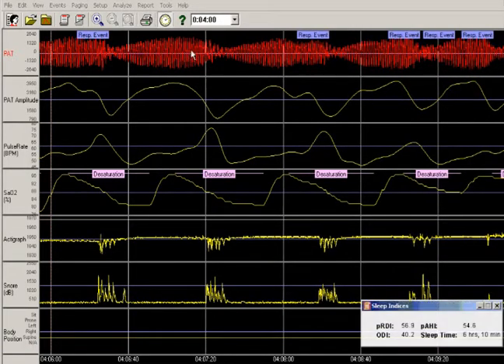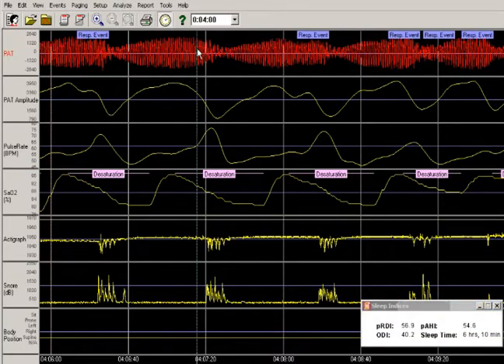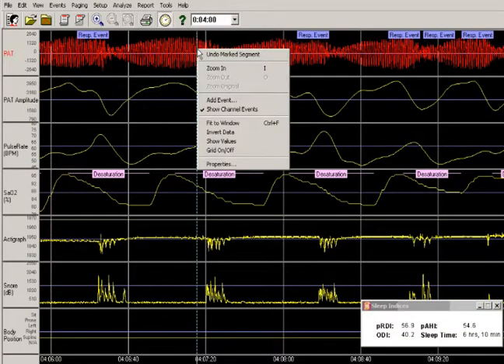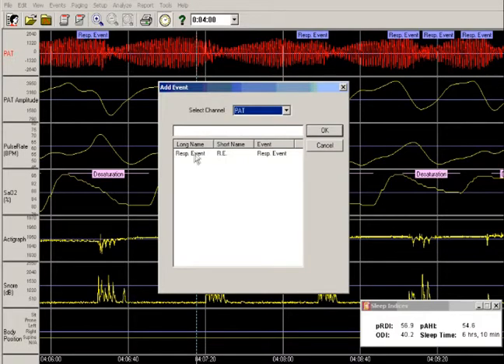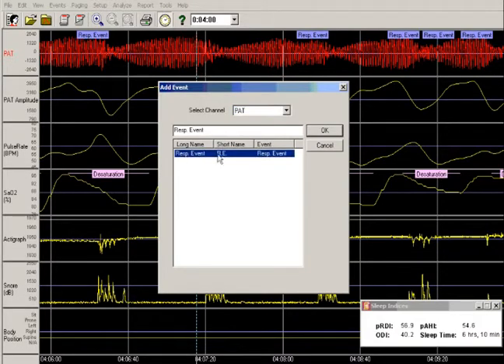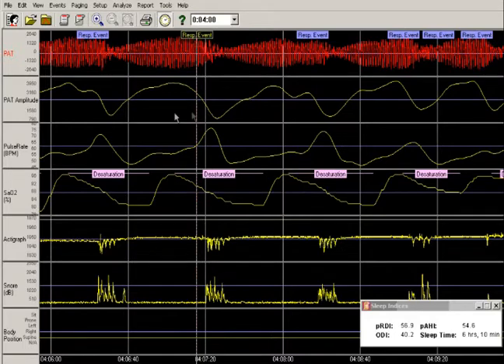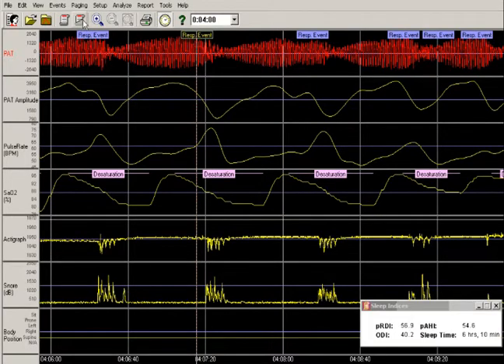To add an event, simply right-click at the place where an event should be added. Select Add event from the menu, choose Respiratory event and press OK. The scoring will be recalculated accordingly.